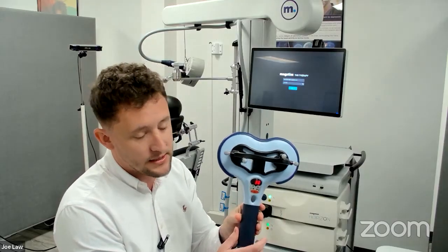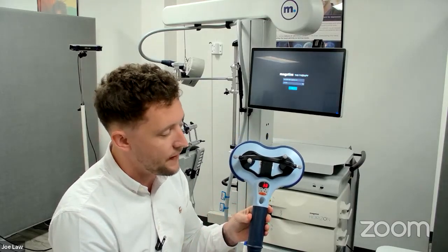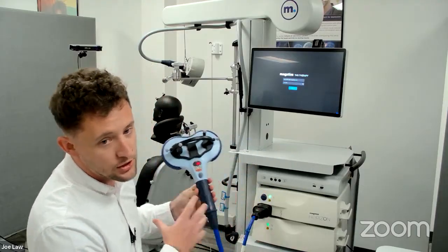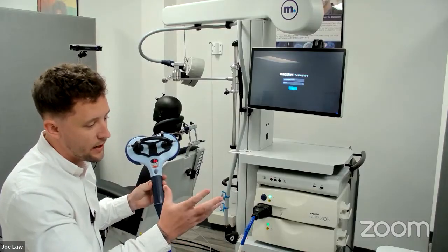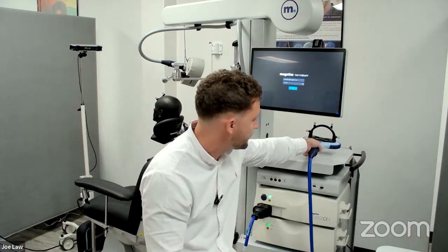The thing I like about this is it's fully remote. So you can change intensities, arm the system, fire the system, all from the patient. You never have to leave the patient's side and interact with the screen because you can control it with your thumb from the actual mapping coil itself.